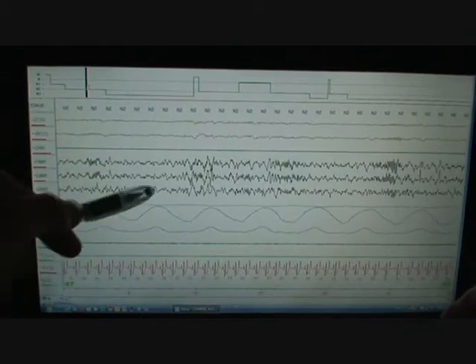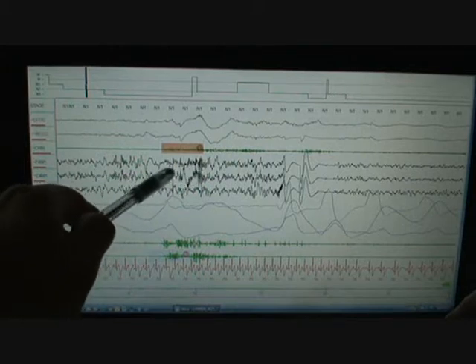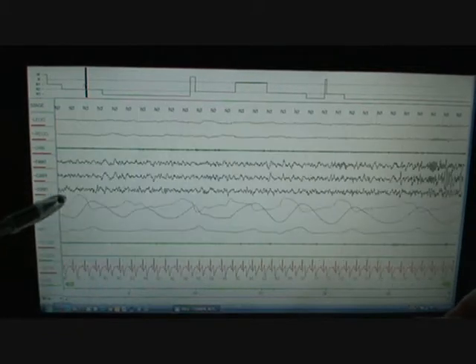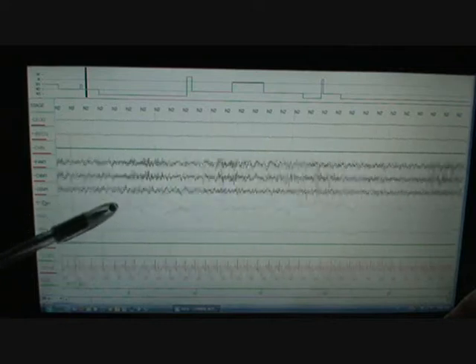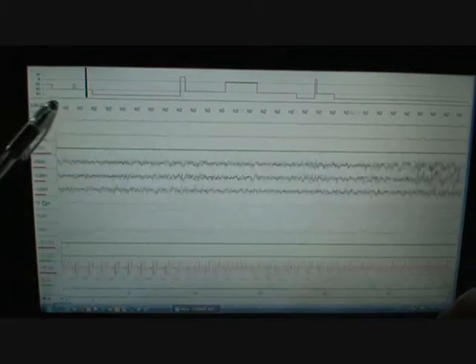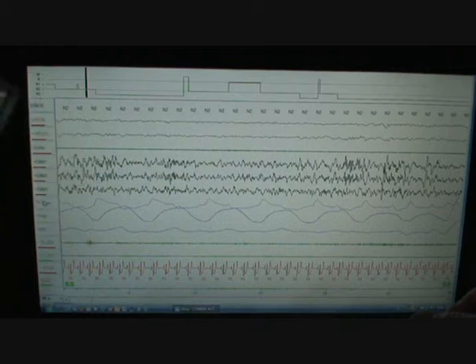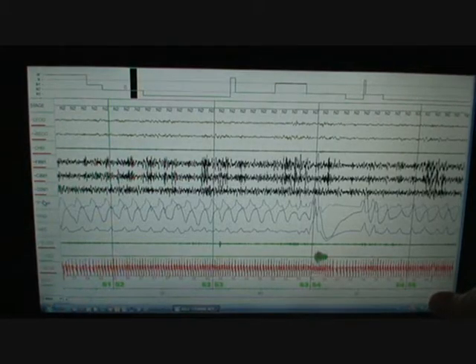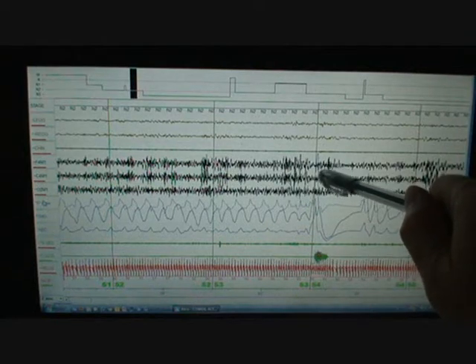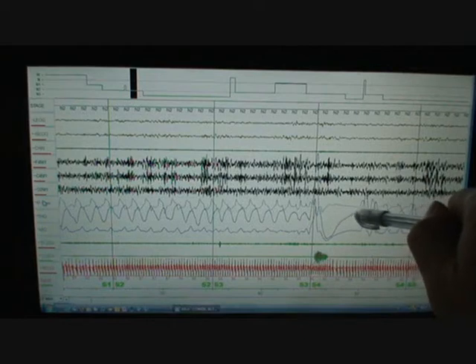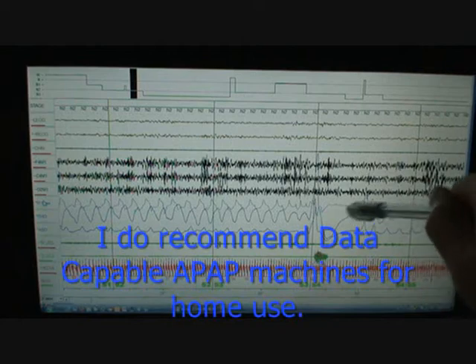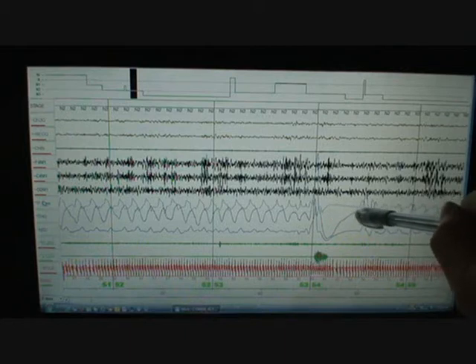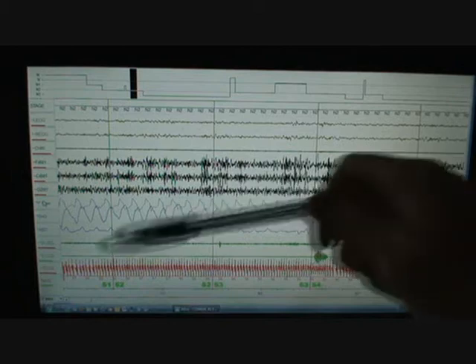So let's speed up until we get to something kind of good. Well, right here you can see they're sleeping and then they wake up. You can tell because this gets fast and thick, and I've marked this as a leg movement with an arousal. This is kind of interesting right here. This is something that a lot of people do. You see that we're not really even awakening. It's more of a sigh. They move their legs and then all of a sudden they stop breathing. Well, that's normal. You do that all the time. You do that when you're awake, if you yawn or sigh, you pause breathing for a while because you just don't have that respiratory drive. Well, the machine's going to pick that up as a central apnea when in fact, it really shouldn't be called a central apnea.